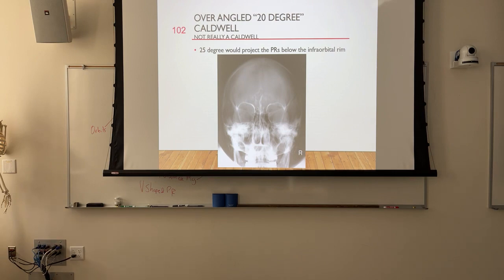So, I think I started this last week with you may never do any skull work, right? Just because everybody's going to go to CT. If there's something going on inside of the head, they need to see really what's going on inside of the head rather than just seeing the bones. So if you're not likely to shoot a skull series, you're definitely not likely to shoot any of these. So just file it away.